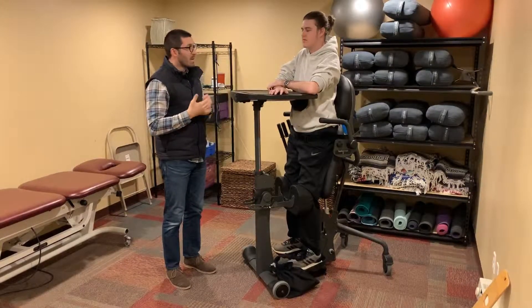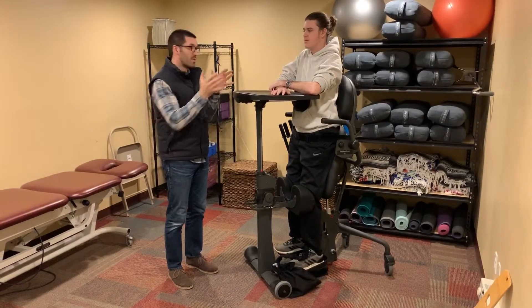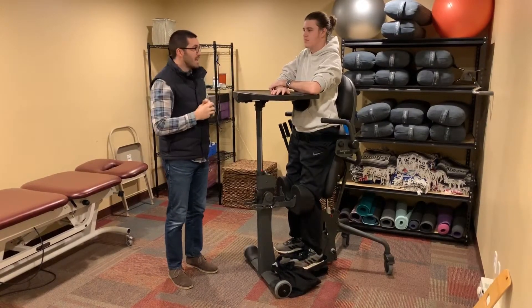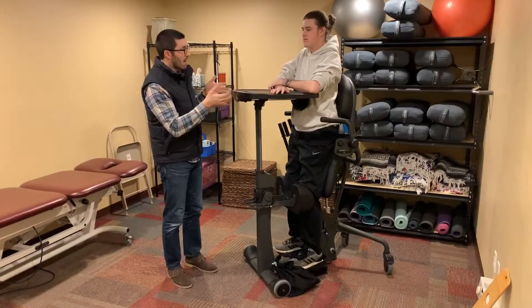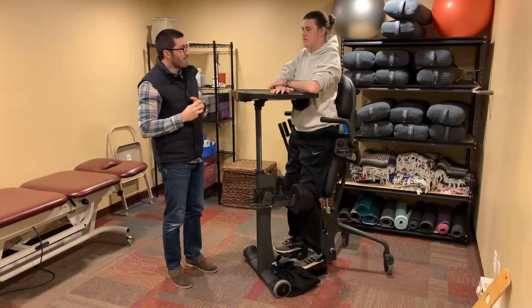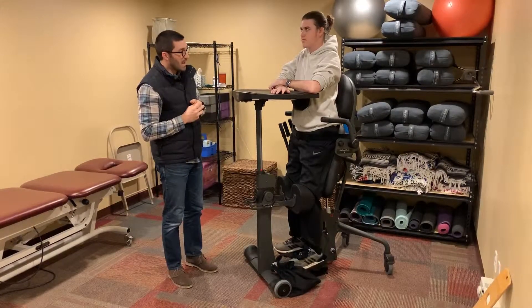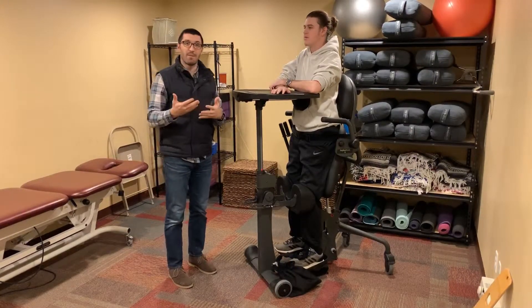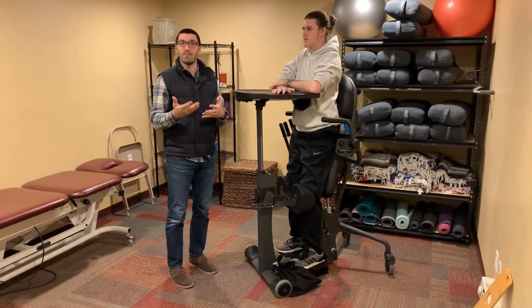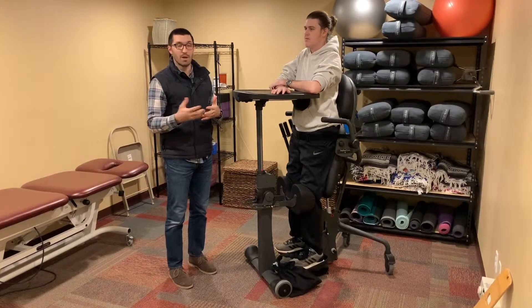When he was tolerating that for about 20 minutes, we were able to shift over into the stand table and figure out the right configuration for him. Then we were looking at what types of things we need to add to his body to help maintain blood pressure.